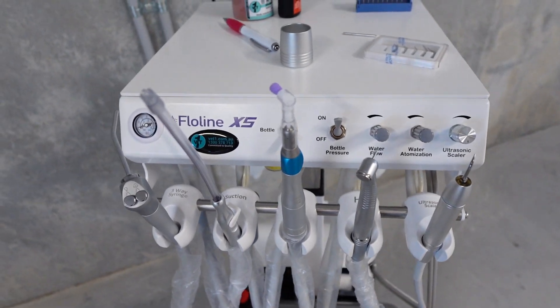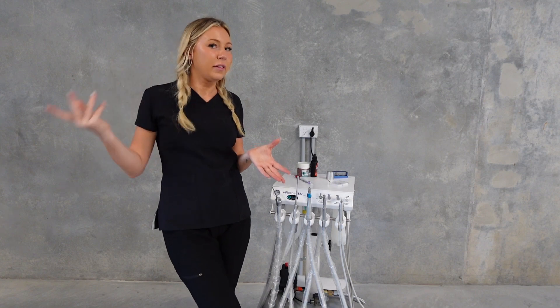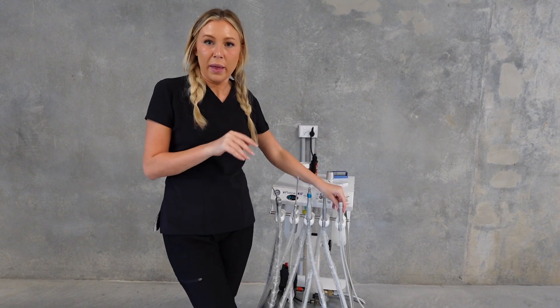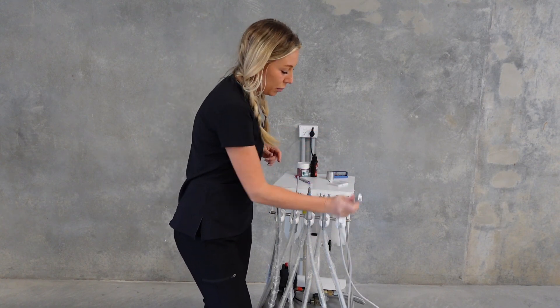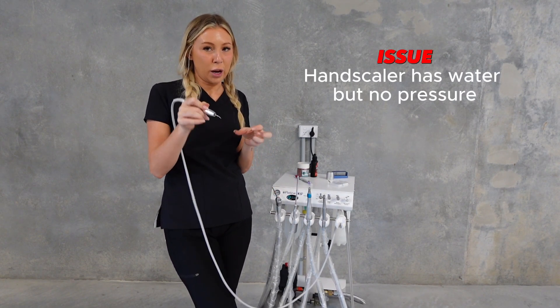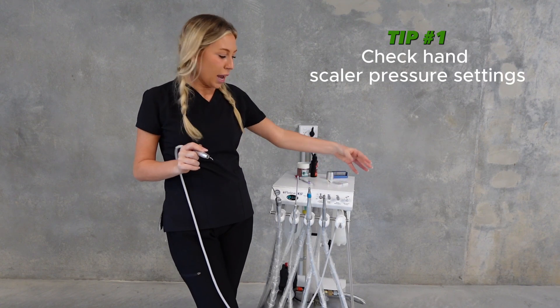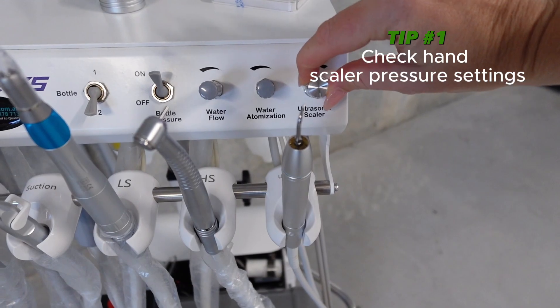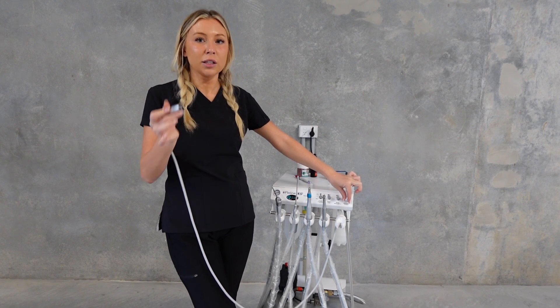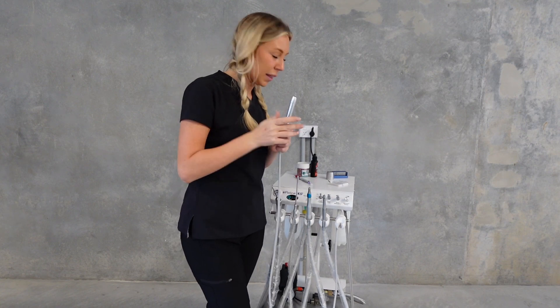Starting with the scaler handpiece - say I've got water coming out but I don't actually have any pressure, so it's not actually scaling effectively. I'm going to look at my settings here - on this machine they're right at the front. This dial might be turned off or just too low. I'm going to turn it up until I'm at a desirable scaling pressure.